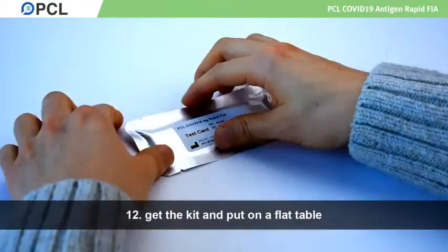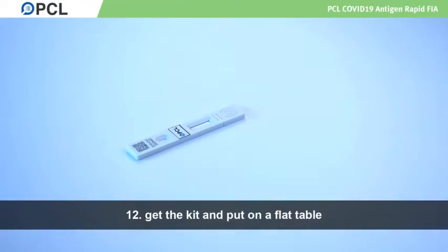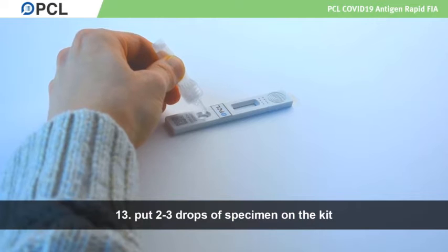Get the testing kit out of the pouch and place it on a flat table. Release two to three drops from the tube containing the specimen onto the well of the kit.